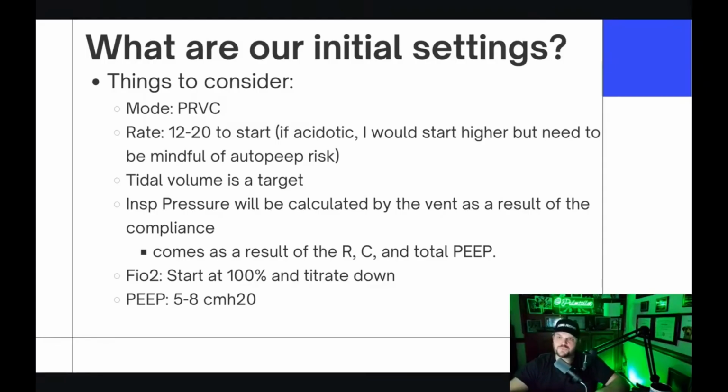There's a real harm with PRVC and other adaptive modes because as the work of breathing goes up, the support from the ventilator goes down. And 9 times out of 10, no one recognizes that. So what I see is patients being tortured on the ventilator. Remember from the first slide that Instagram Live can't see, the first slide said we should prevent death and torture, right? We should avoid death and torture with the mechanical ventilator. That would be the first thing we should do. And the way that we torture people most of the time is with our settings, because we don't understand the ventilator. And that's what we're trying to do here.